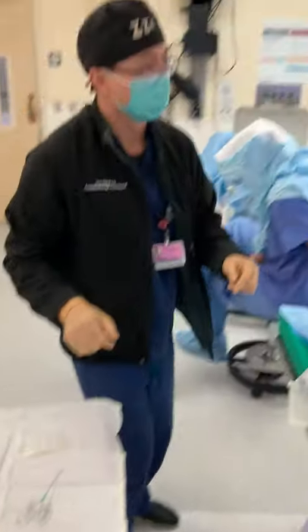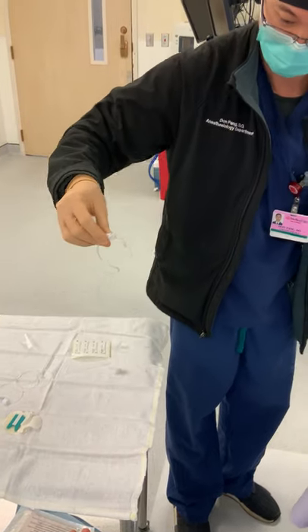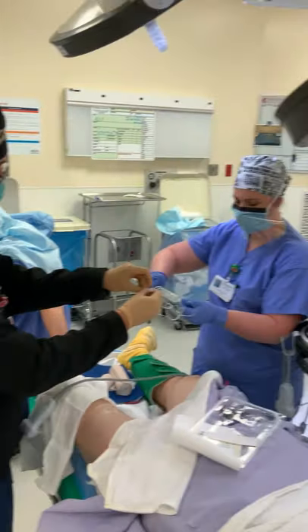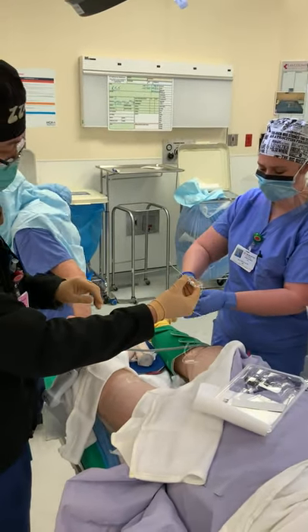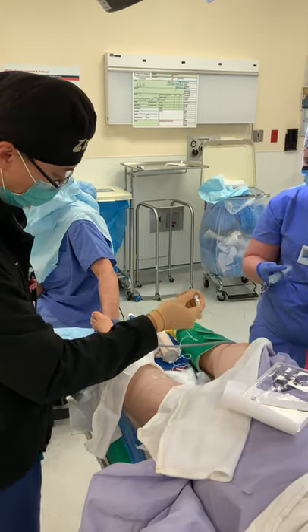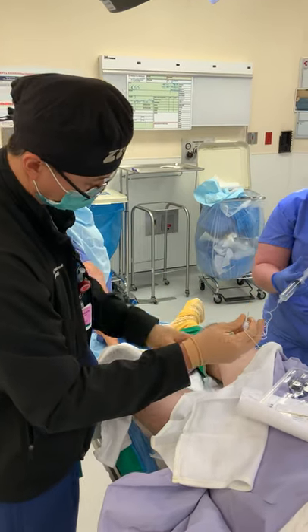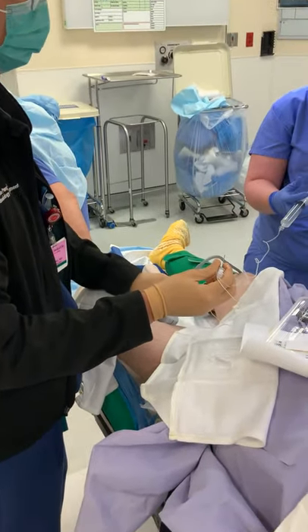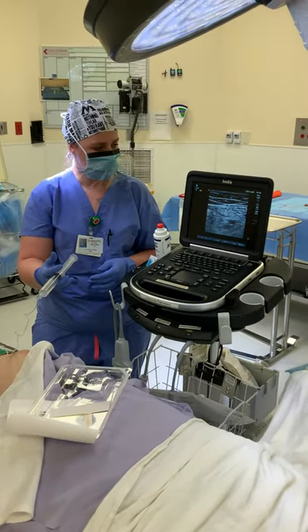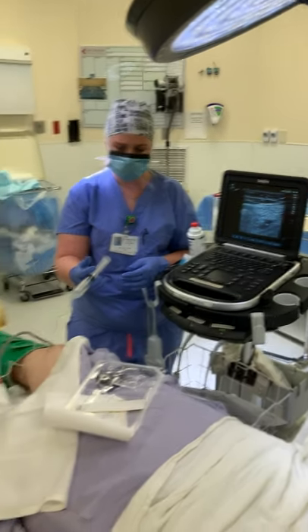We are going to start by having our assistant connect the medicine to that green needle. We're going to flush through and get all that air out. We'll treat this just like a single shot block. I'm going to get my ultrasound here. This is the adductor canal block, and here we have a good image of this sartorius muscle and the artery right beneath. So let's go for that.